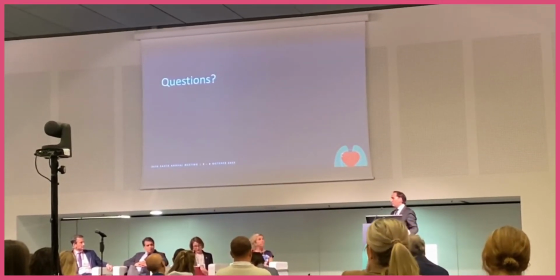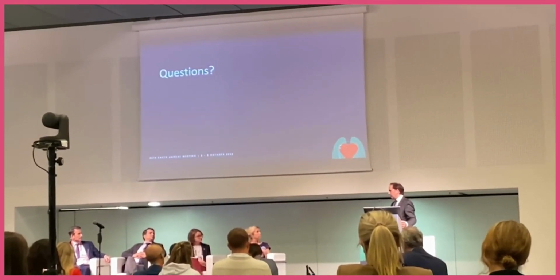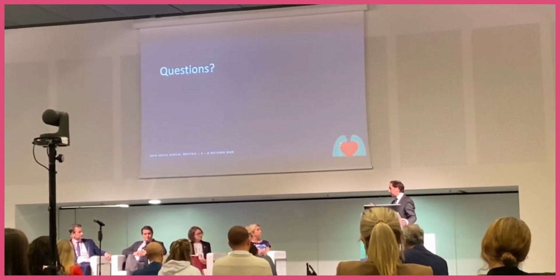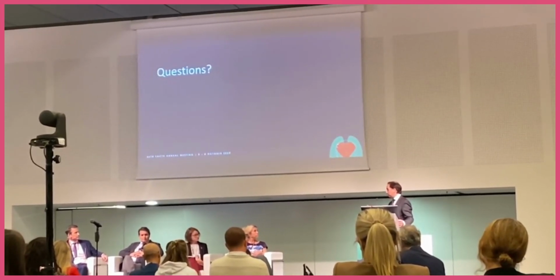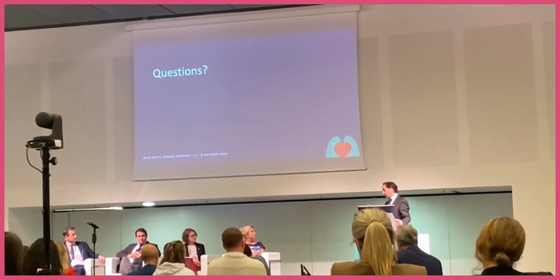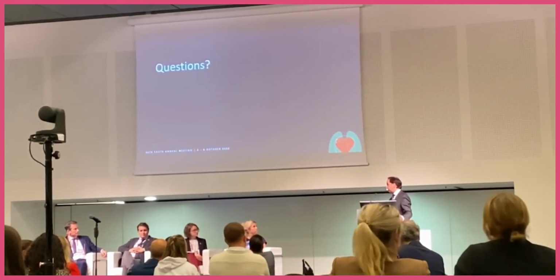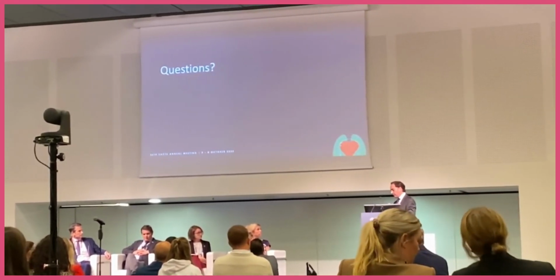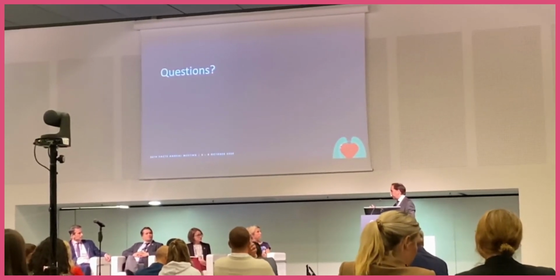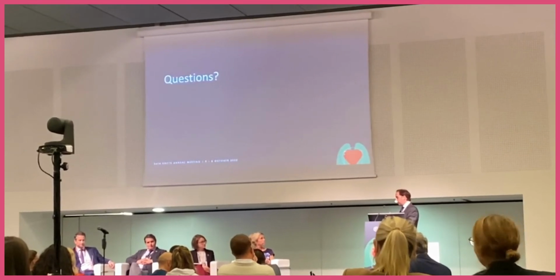I think the hallmark is that it's a laser welded anastomosis. I think it's very easy to use. It's a clip with a very limited number of mechanical parts. So you open it up, you position the vessel, and then the laser goes in and docks. I think there is the biggest technical challenge. So the modifications probably needed in the future should be aimed at that stabilization of the laser catheter and fixation. That's part of it. And the rest of the procedure is very simple.